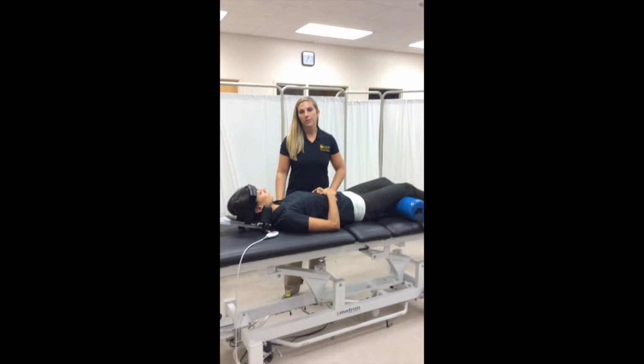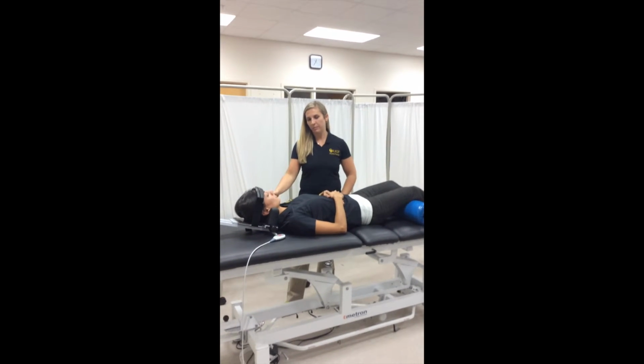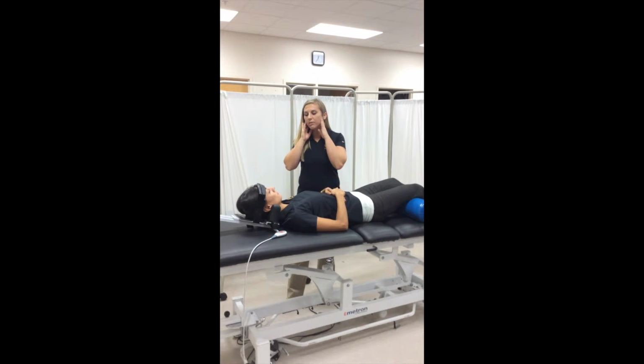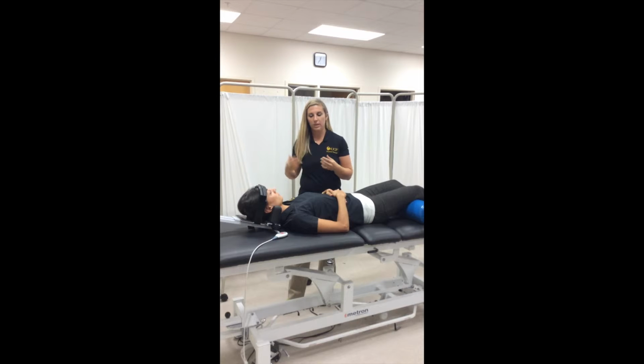The expected outcomes for this procedure is going to be to decrease the muscle spasms via relaxation of the right paraspinals, to increase the right lateral bending strength, and increase active motion for left rotation and left lateral bending. Okay, so before we start the treatment, I'm going to make sure to tell my patient what she's expected to feel. So you're going to have a light pulling sensation around your neck muscles, and it's going to be experienced in the back of your neck.